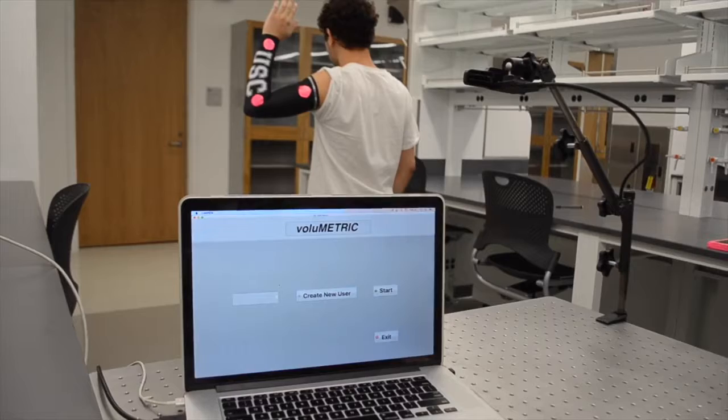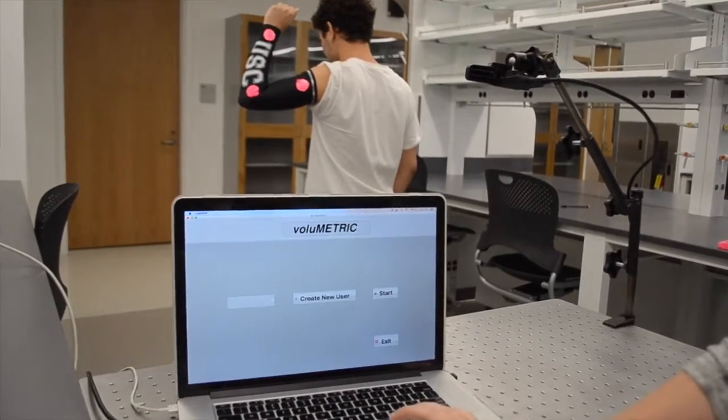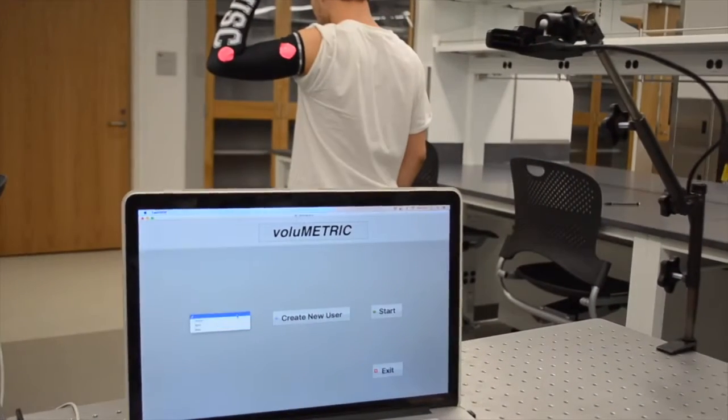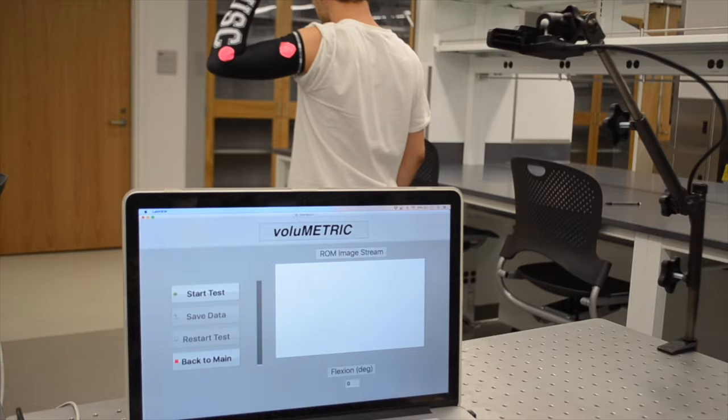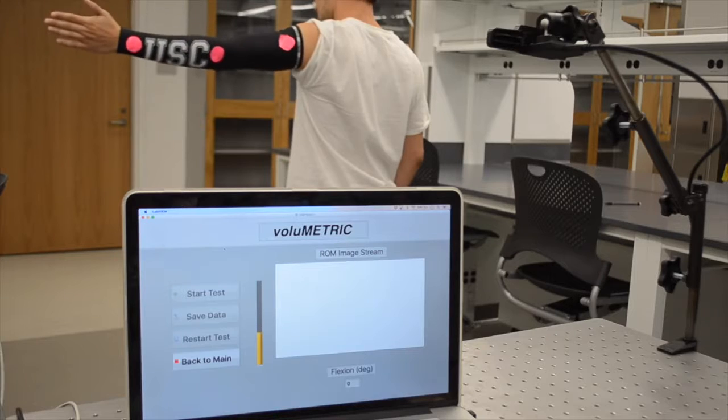The second test that our system can perform is a range of motion test. In this case, we're performing a range of motion test on Carlos's elbow. So we can select Carlos's profile and press start. Now we go to the range of motion test. Press start test. And the system indicates that the camera will take a photo of Carlos. He now moves his arm from the top position to the 180-degree position. This is simulating a full range of motion.